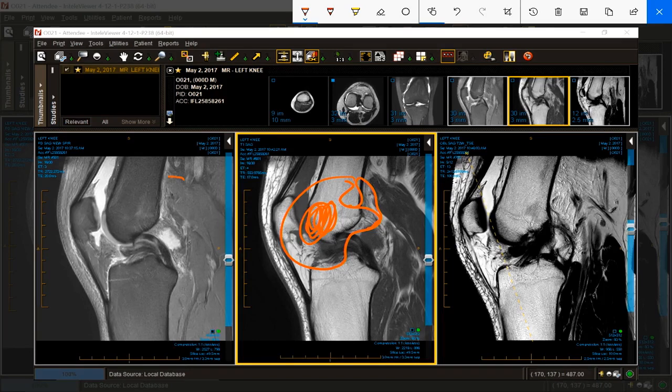Quick draw of some other meniscal tears. This would be a radial tear, little triangle right from the inside. When they're 8 millimeters deep, you may have to resect them. If you have a little radial tear and it decides to curve, you call it a parrot beak. If it's a big curve, you call it a flap, which is one of the more common tears. If you've got a tear that has a nice horizontal axis, it's a cleavage tear. They can be traumatic or degenerative.